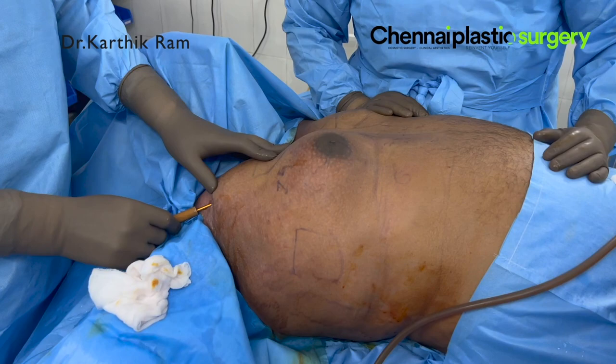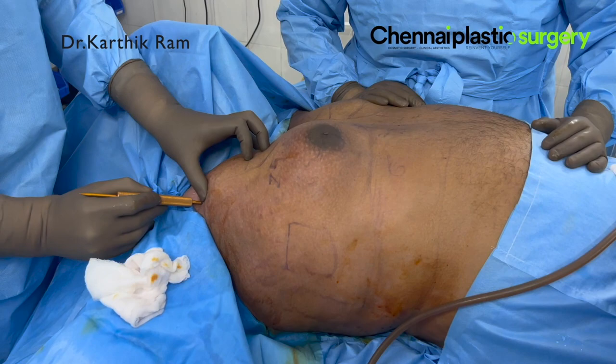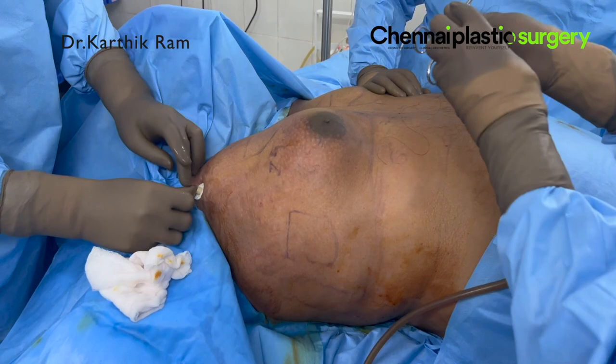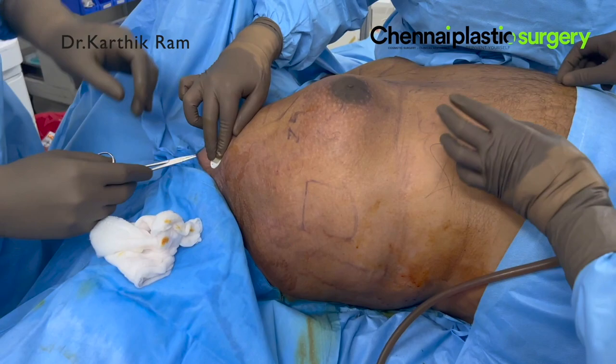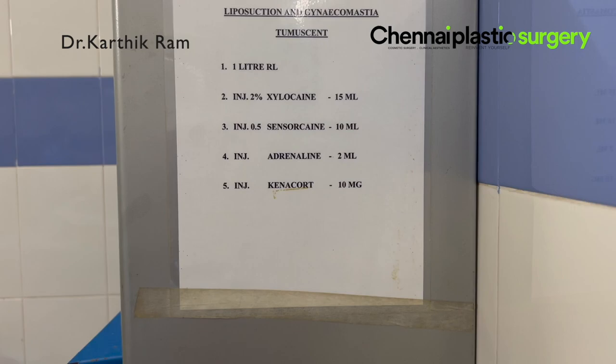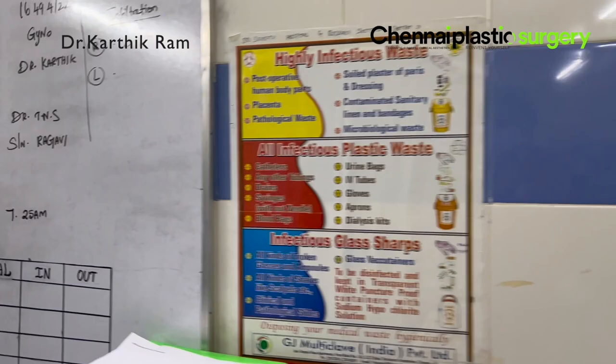This is the trocar we use before the VASER to fix the guard at the incision site. We are fixing the guard there — this reduces burns around the incision site, both in the VASER as well as in the micro-air. This is the tumescent anesthesia solution; whatever we mix is shown in the chart. Instead of sensorcaine, we are using ropivacaine nowadays. As you can see, we infiltrated almost 3 liters on the right side alone.